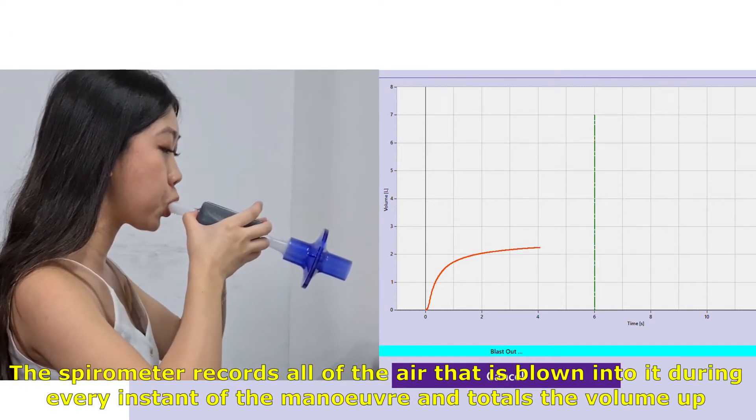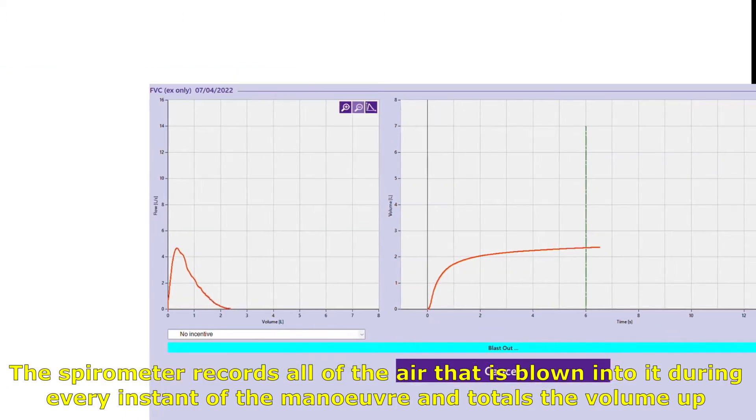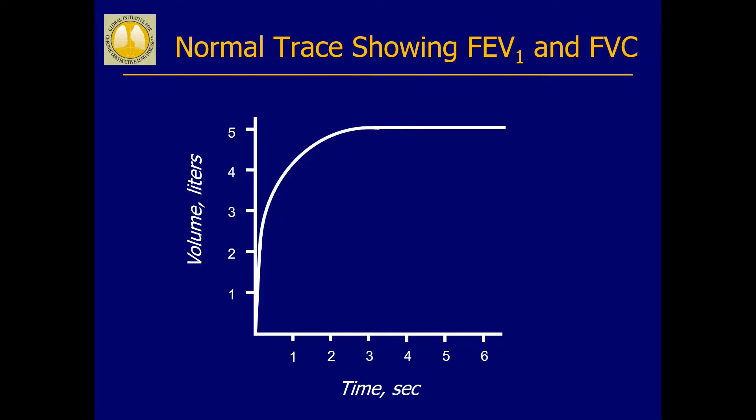The spirometer records all of the air that is blown into it during every instant of the manoeuvre and totals the volume up. Spirometry provides your doctor with two essential bits of data: FEV1 and FVC.